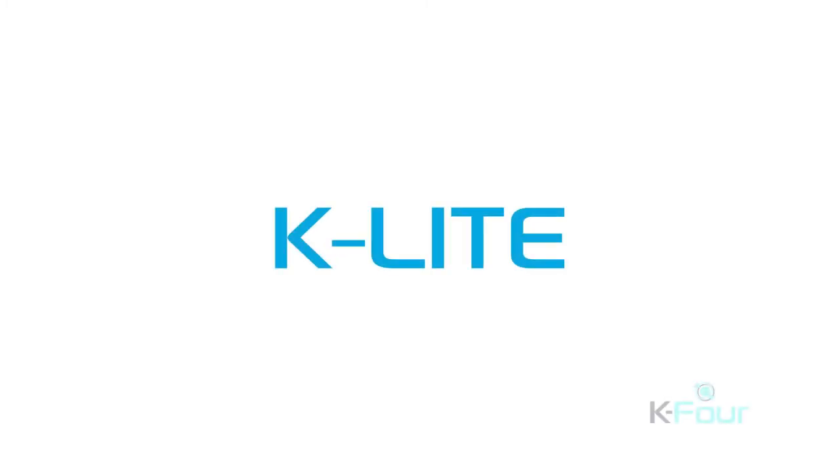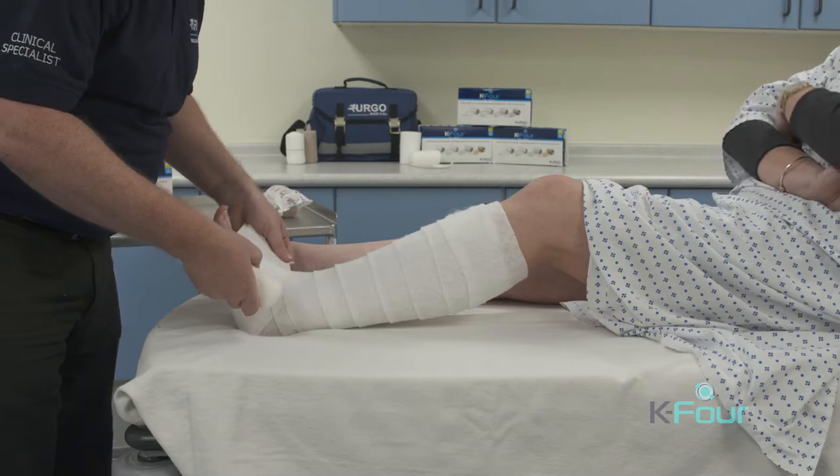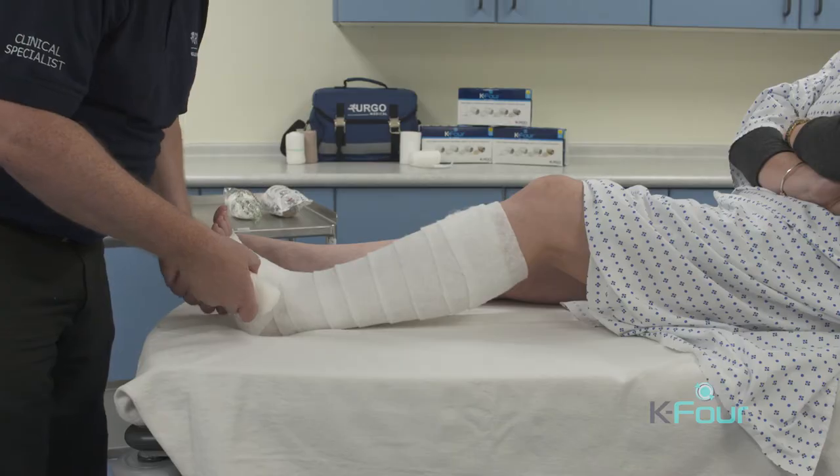The second layer is K-Lite. K-Lite is a light conforming bandage with no compression. It's applied with enough stretch so that it lightly conforms to the limb.